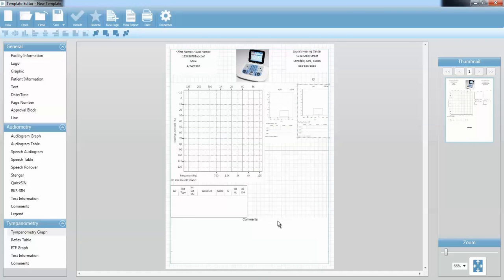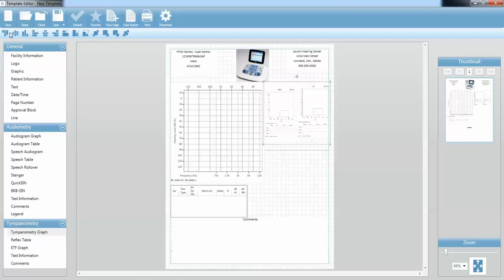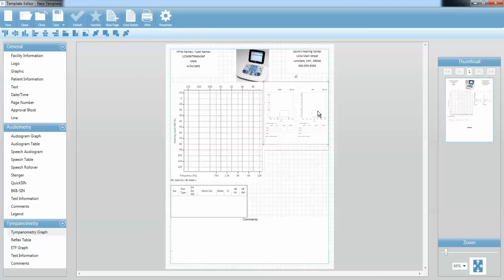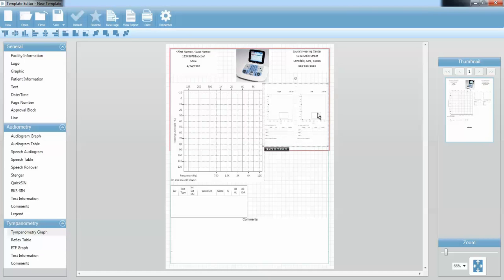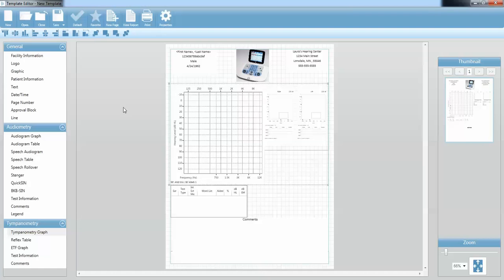I want my tympanometry graphs to be the same size. I can click on one, press and hold the Control key and click on the other to select both of them. Up here I have a lot of different options for aligning. I clicked Align the Tops and now I'm going to click Make the Same Size. Now my tympanometry graphs are the same size. I'm going to select those two and my audiogram and make the tops line up.